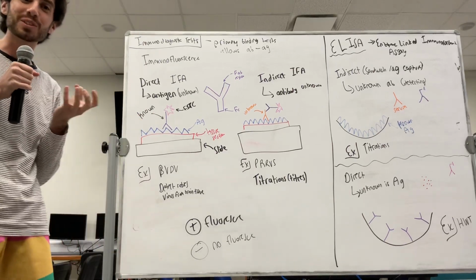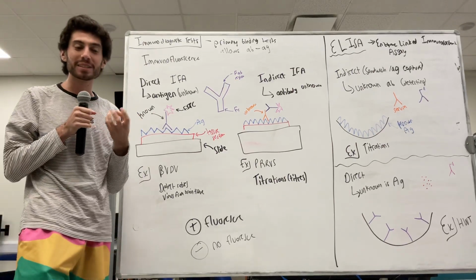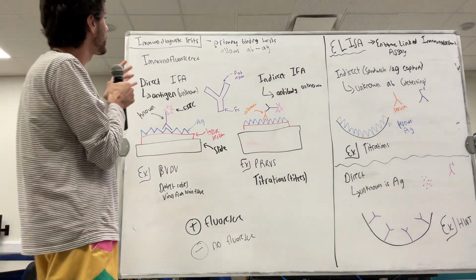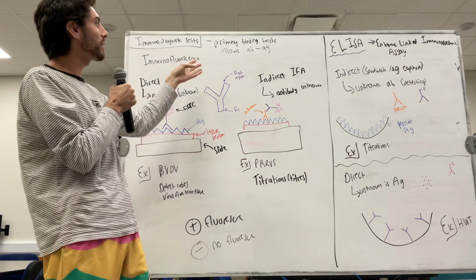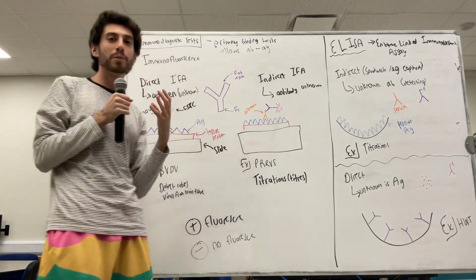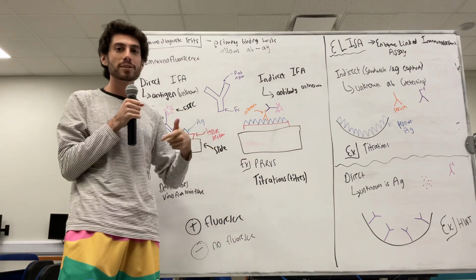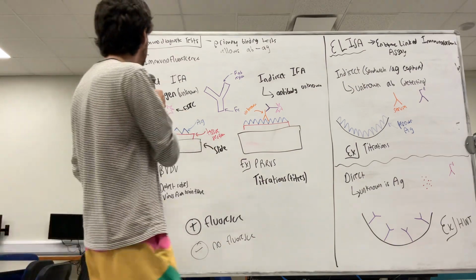Okay, hi. So we're gathered here tonight, or today, this morning, depending on when you're watching this, to talk about a couple of immunodiagnostic tests, specifically some primary binding tests. And when we say primary binding, that's antibody binding to antigen directly. So let's just get right into it.